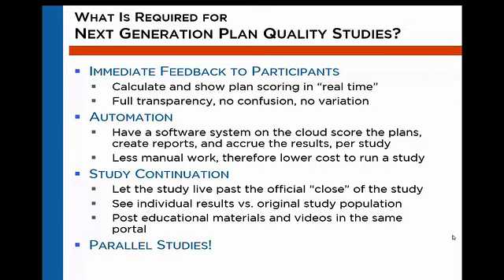And not only that, but after the initial presentation or publication has been made, we're going to allow you a portal that you can interactively look at your results versus the population using some pretty powerful and cool tools we've built on the website. So finally, we want to post the education materials when we derive who the high performers are, what the best practices are for a certain planning system, what techniques work best. We want to provide a one-stop shop where some of those things can be gathered.